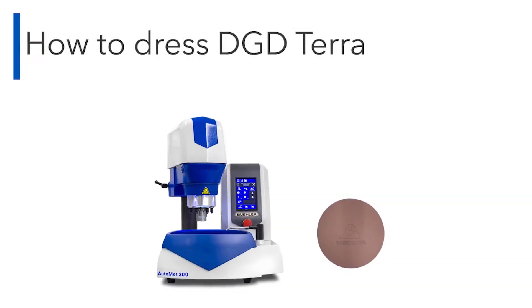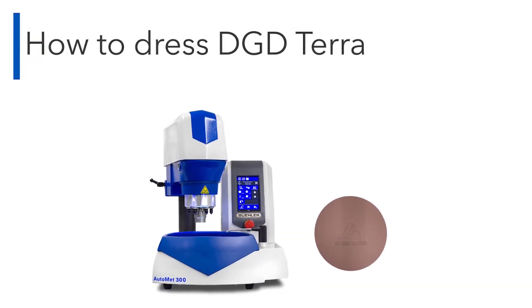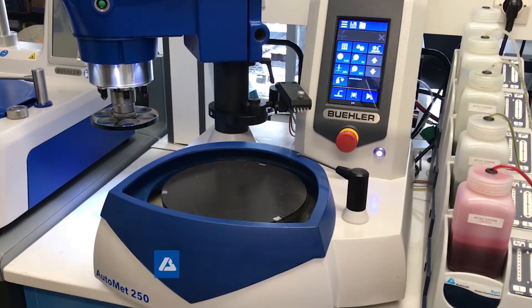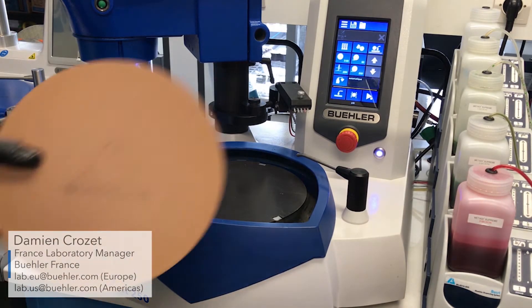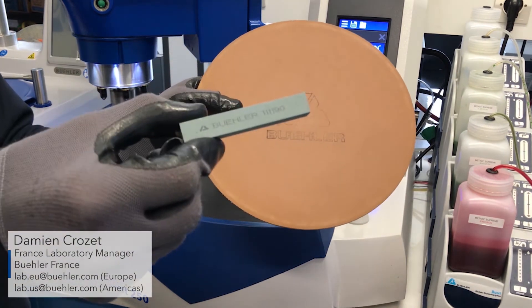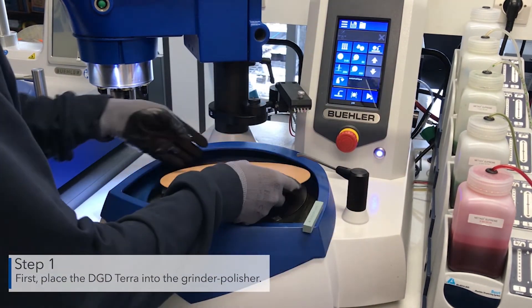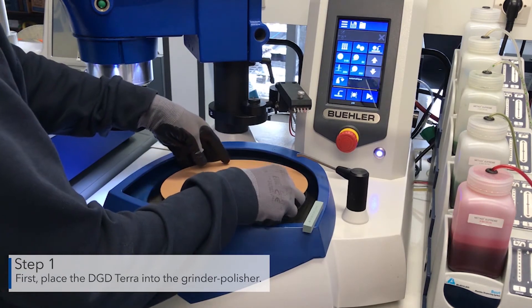Welcome to Beeler's how-to video on how to dress DGD Terra. First, place the DGD Terra into the grinder polisher.